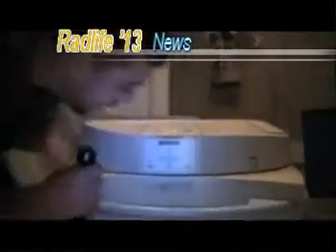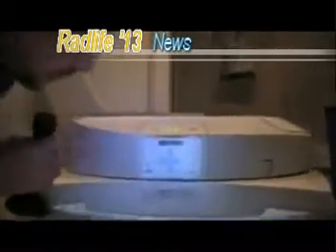Down here we have the buttons that are on the bucky control panel. If you notice, we have the up arrow, which will move the bucky up, and the down arrow, which moves the bucky down. These control our whole tube and bucky alignment, which if I push this, the bucky and the tube will angle in the same direction. If I depress the shift, as I talked about earlier, and then push the button, only the tube will move, so that the central ray can be angled caudad or cephalad.